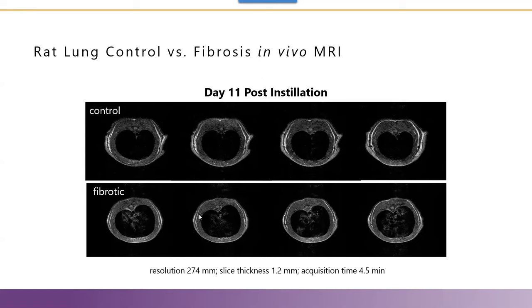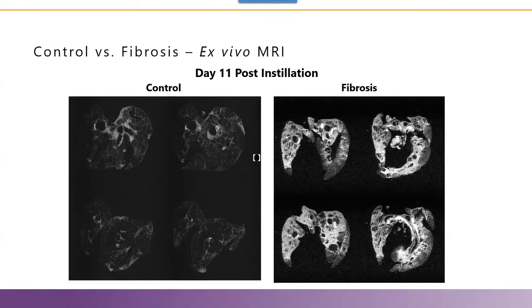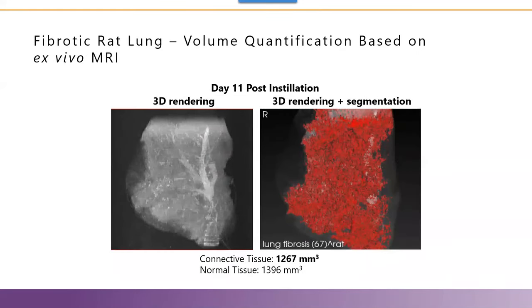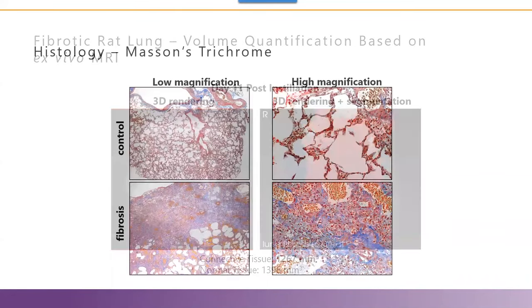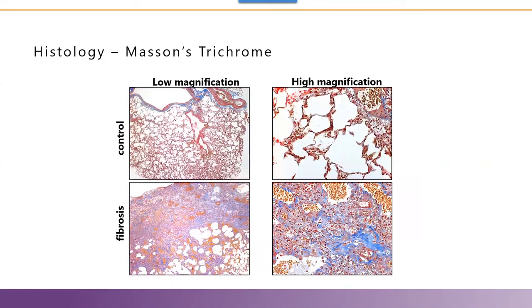The pale regions seen at the bottom in the treated lungs represent fibrotic tissue as well as inflammation — you can see it here in multiple locations. Using ex vivo MR, significant pale areas are clearly demonstrated in the fibrotic lungs. The ex vivo segmentation of the fibrotic areas enables exact measurement of fibrotic tissue volume in comparison to normal tissue. Using histopathology with Masson's trichrome staining, it was possible to validate the presence of fibrosis in the previously shown red segmented areas.